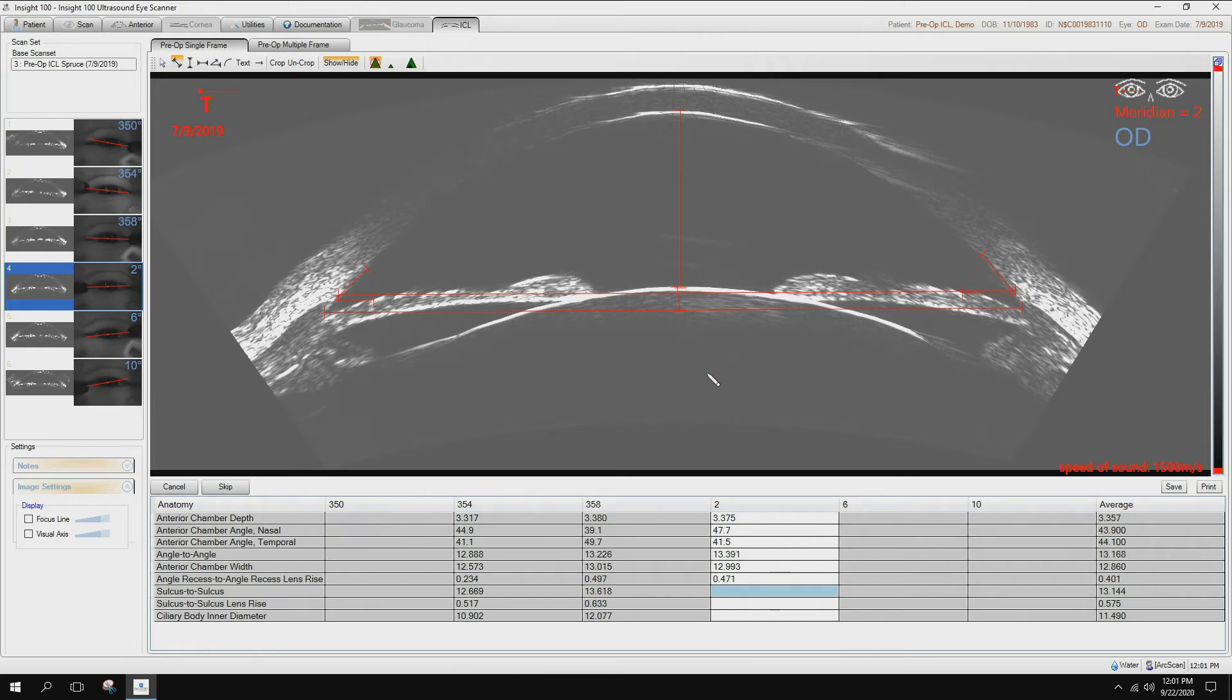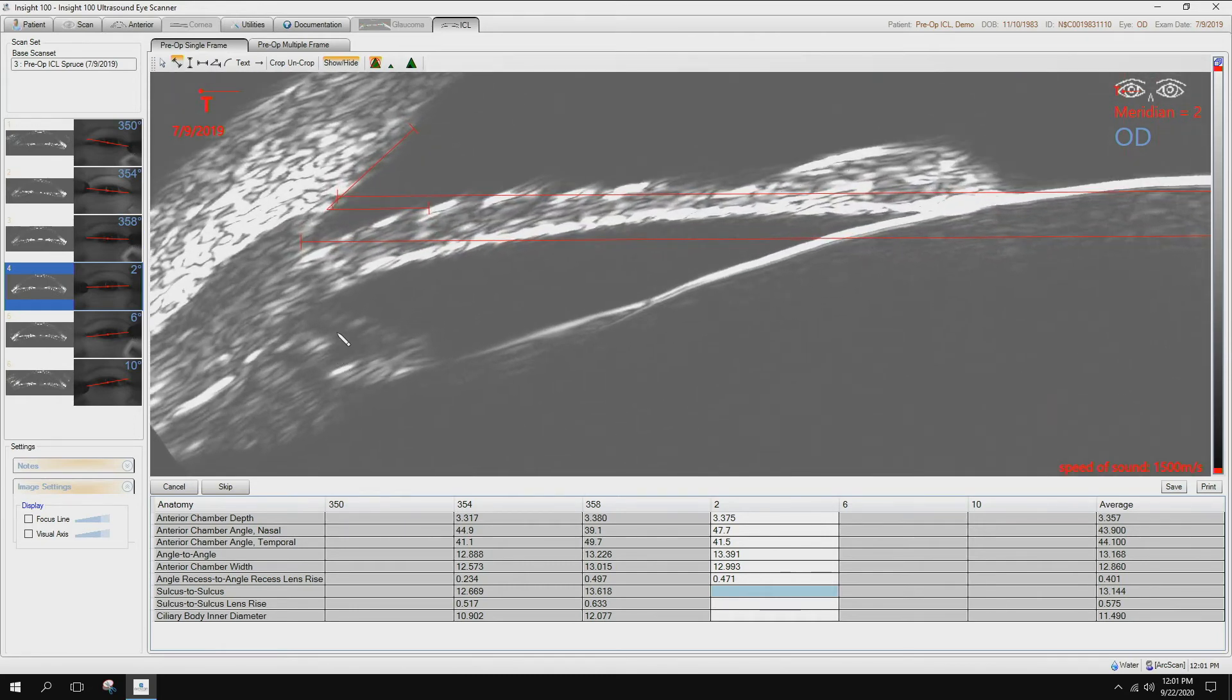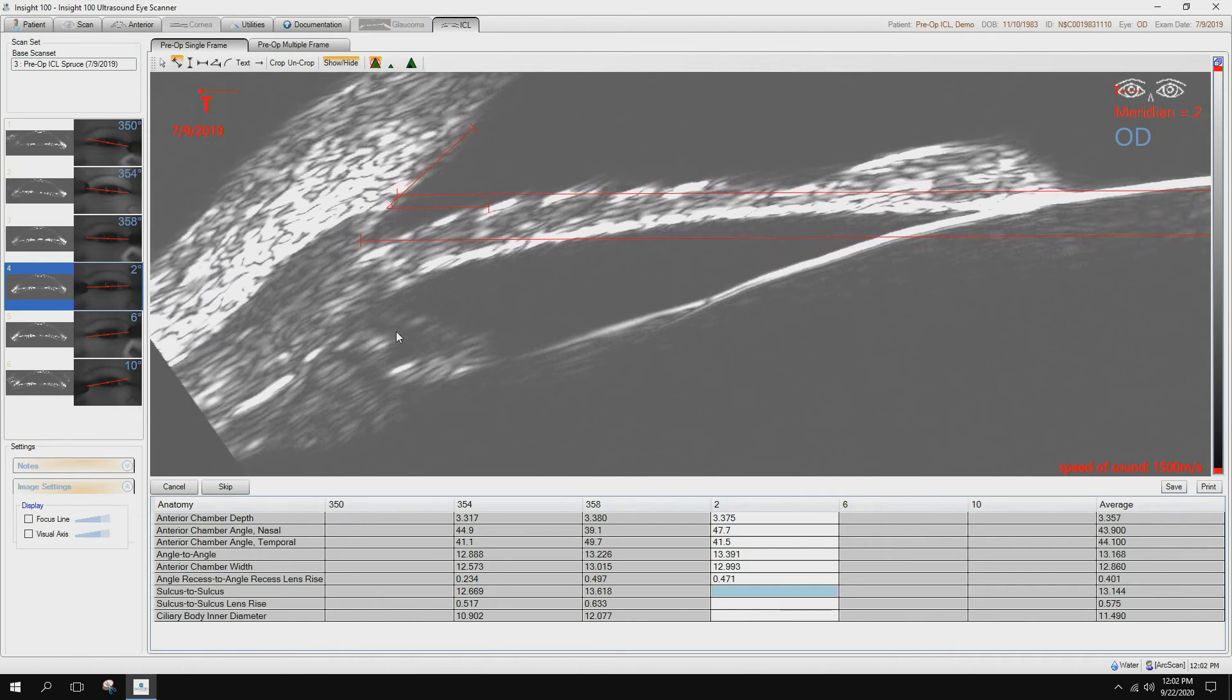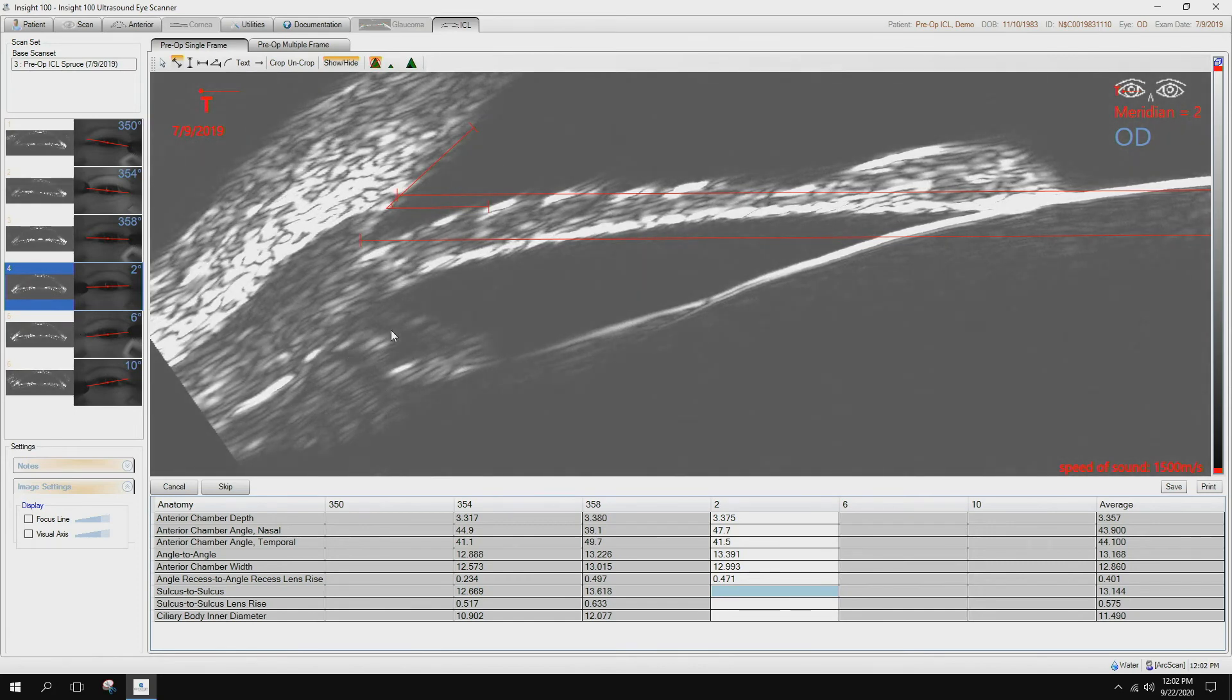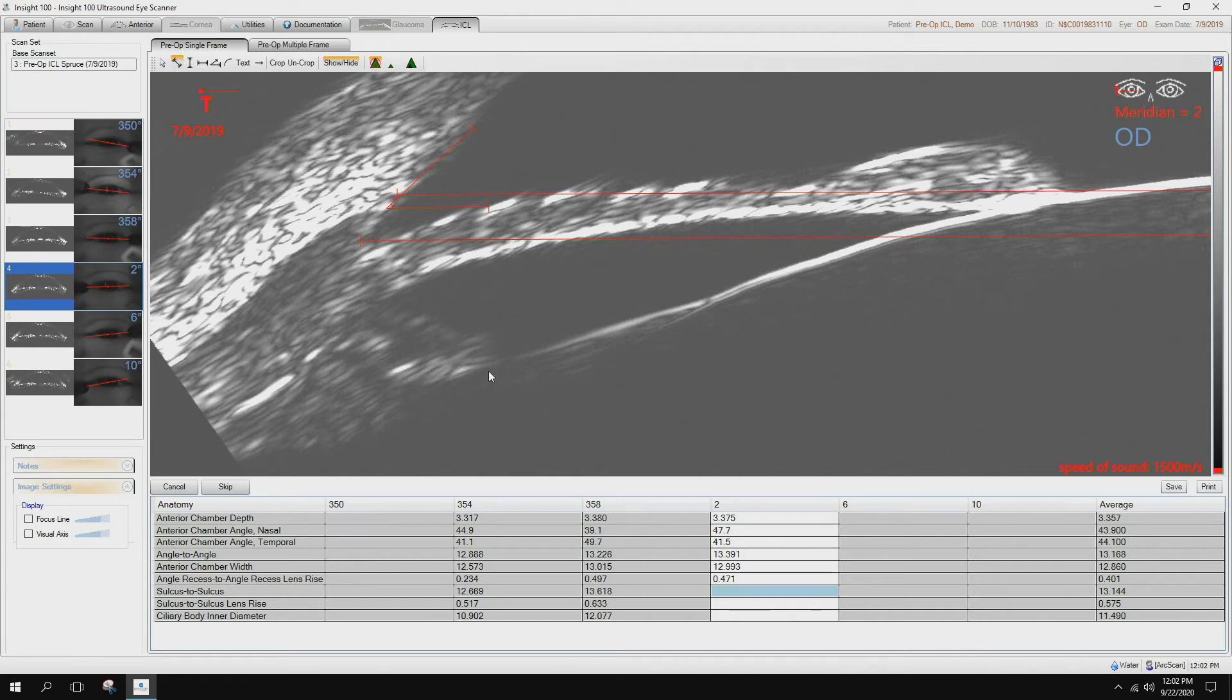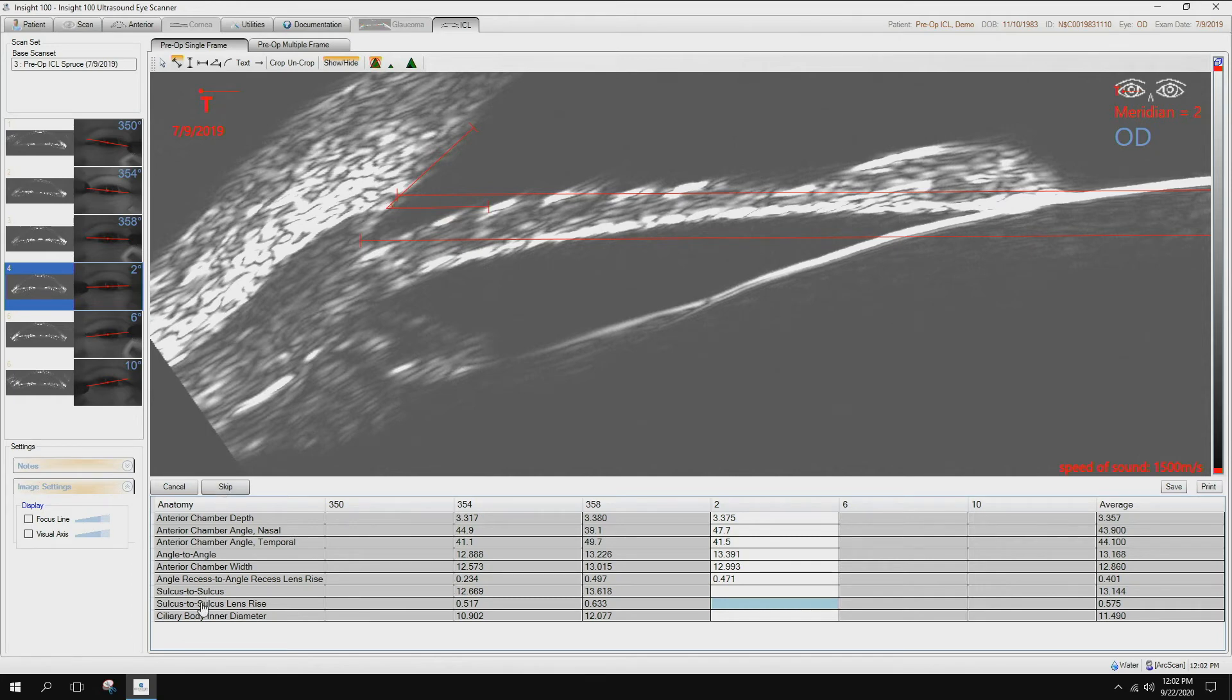Sulcus to sulcus. Let's say that this was a little bit dim over here. We couldn't quite see it well enough. Well, you can zoom in. I can hold the mouse wheel down and I can rotate back and forth. The right mouse, I can change contrast, brightness. It's not really clearly defined to me where that actually ends. Obviously, with the ciliary process extruding this way, zonule is coming out of it there. This could be another ciliary process here. Here's another one in the background. So we're not quite clear where that sulcus is. So I am going to use the skip button and skip over that for this particular. Because I skipped that, I'm going to skip the sulcus to sulcus lens rise.